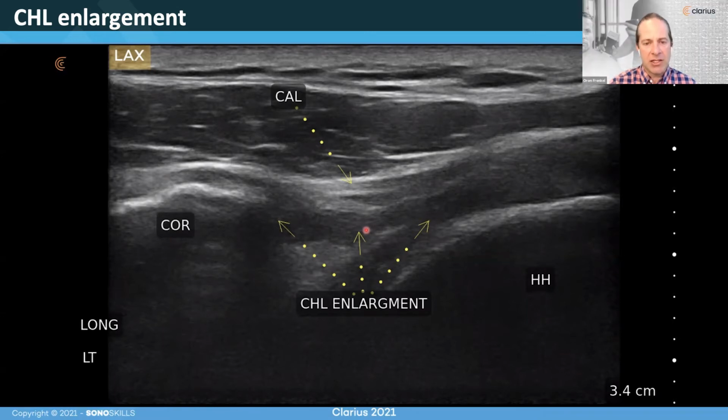I know for diagnostics, you're saying maybe clinical picture first and ultrasound second, but also for many of us doing interventions, it can help guide, because one of the standard interventions for a frozen shoulder is an injection, and you can do the ultrasound guided injection at the same visit. It really can help drive and accelerate treatment pathways too.